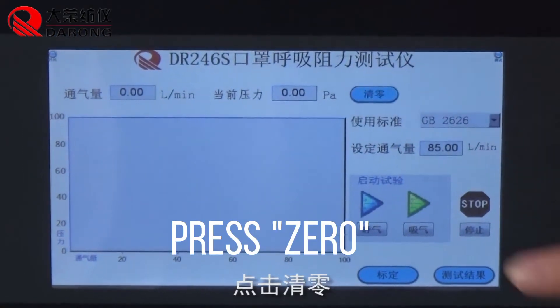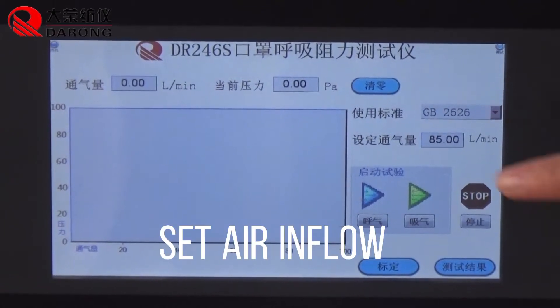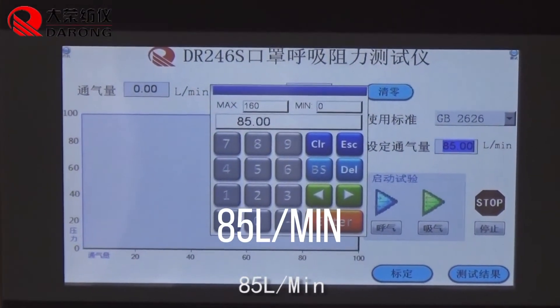Press zero to calibrate. Then set the air inflow to 85 liters per minute.